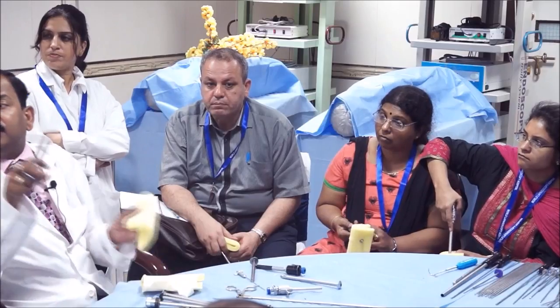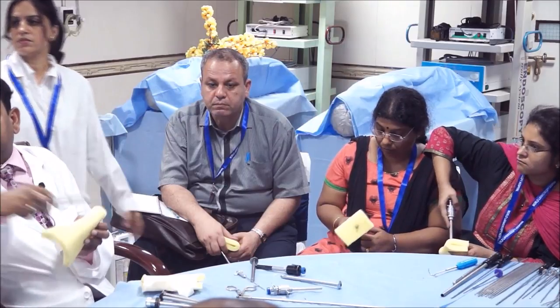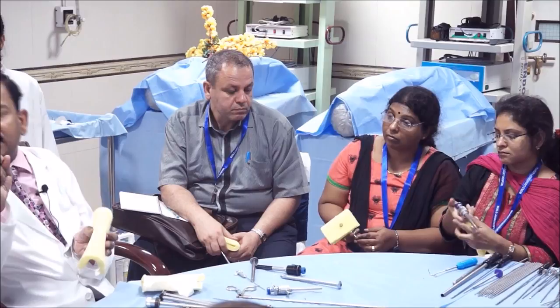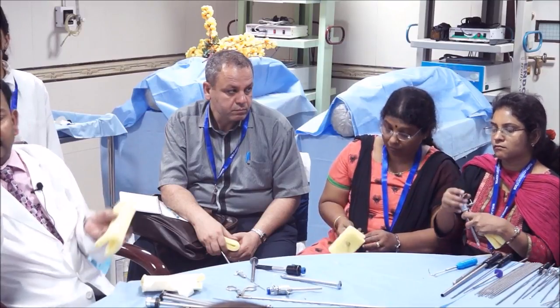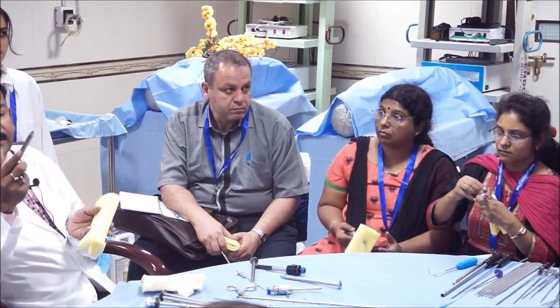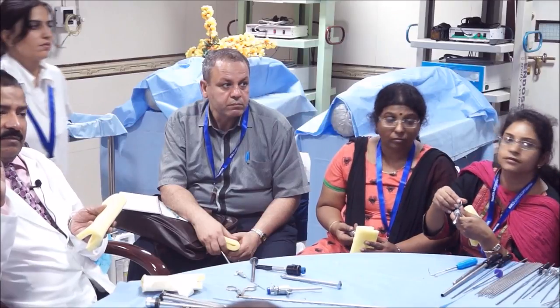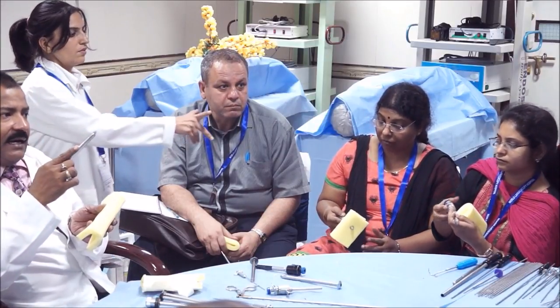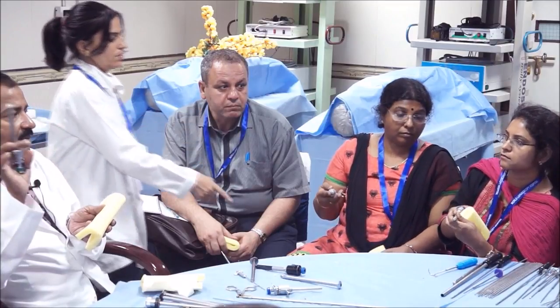This is just to check the sound, and at the end, suppose you want to remove the gas, you can use it at the end of the surgery. Like this, and then the gas will come out. Now another important thing: the index finger is here, pointing towards the sharp end, and the middle finger is wrapping the cannula.